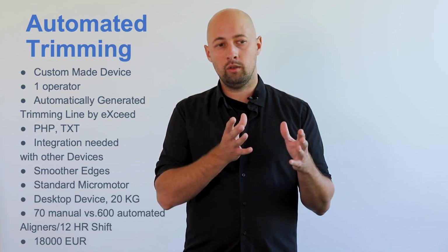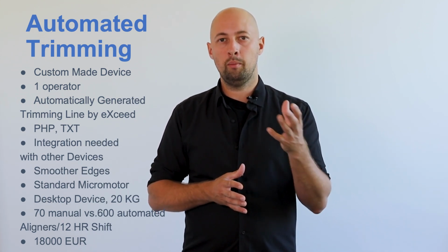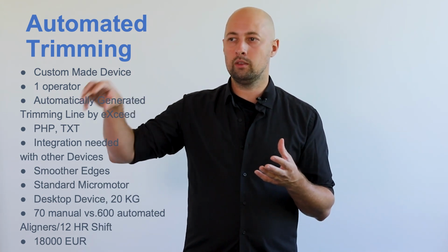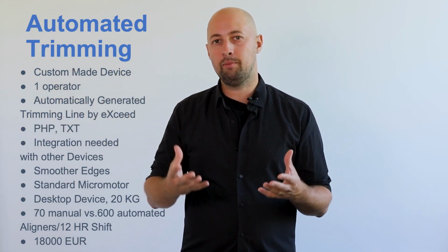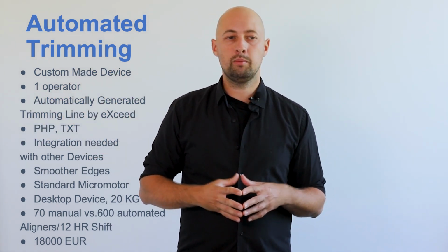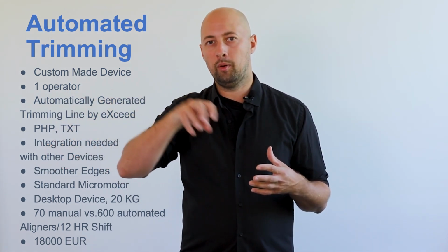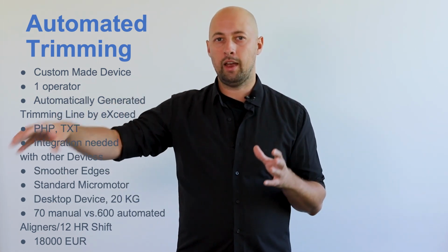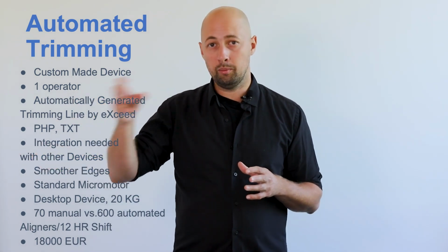And here on the device that we use, as we saw, it's one model per platform, which is important when you want to automate this, also taking the model and putting it on the platform. This is the next step that we're going to implement, and it's much easier to automate one model per platform rather than have 12 mechanical hands taking the models and putting it on the platform.